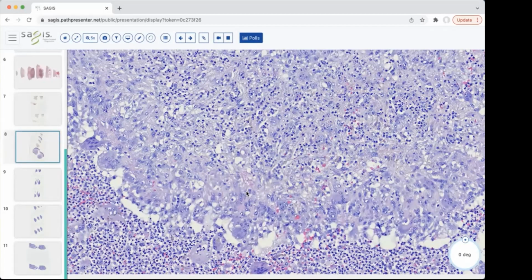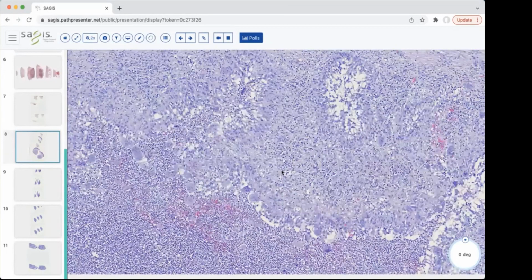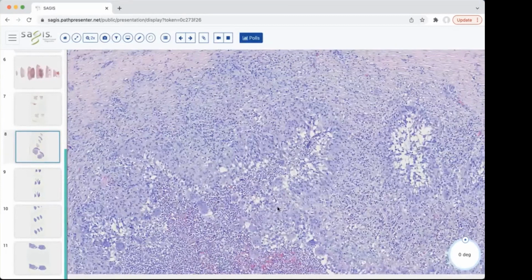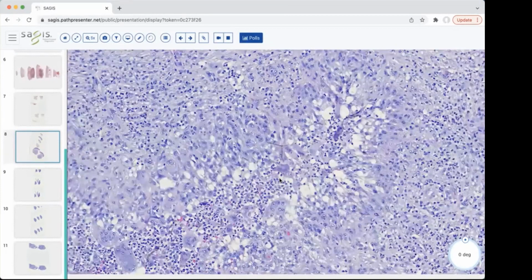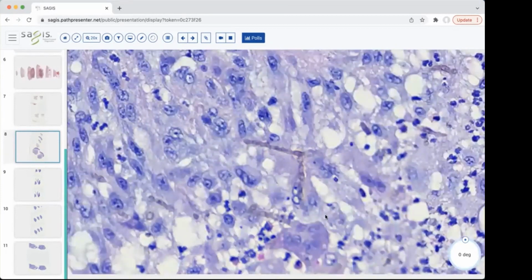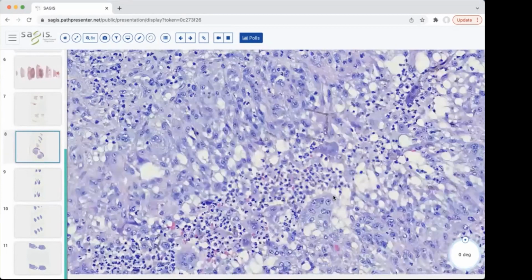We mentioned kind of at the top that the most common thing in skin is a ruptured cyst or follicle. The next most common thing is going to be an infectious etiology. So if you have on the hands and feet a suppurative granulomatous dermatitis, you should really be concerned about organisms. In this case, it has some structures here of these sort of branching fungal elements. So these are hyphae, and you can tell that they have almost like a brown or yellow hue to them.